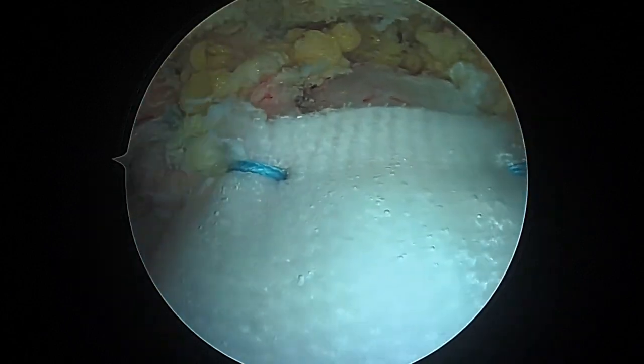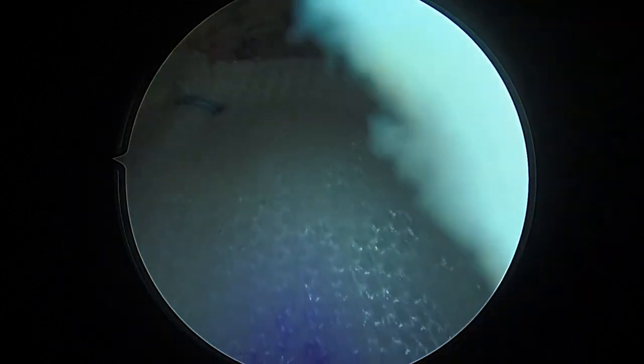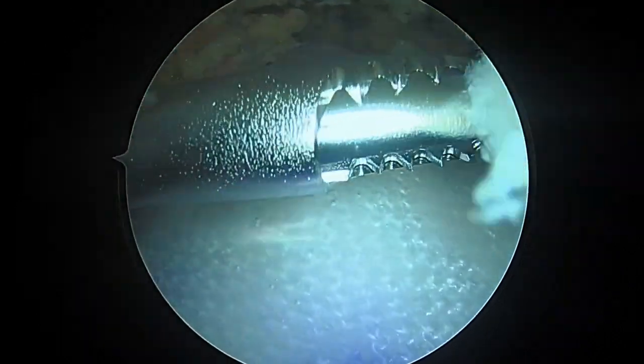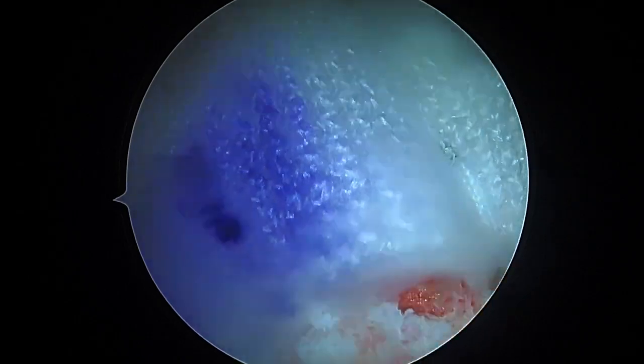We've got our two medial sutures, we've got our two lateral pop locks, and those look very secure. As we rotate, you can see how that graft rotates nicely and just sits right on top of the repaired tissue. Off to the recovery room shortly — good luck to you now, bye bye.